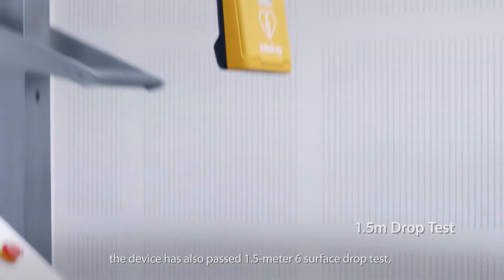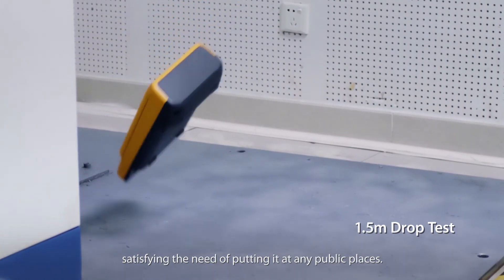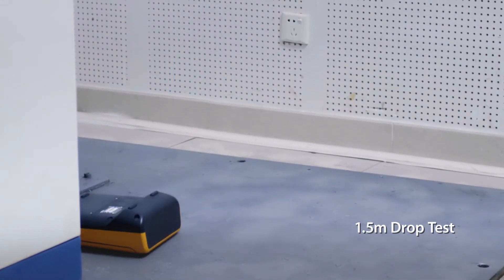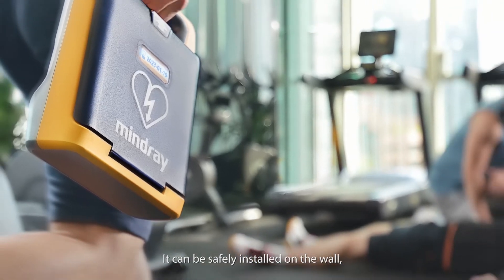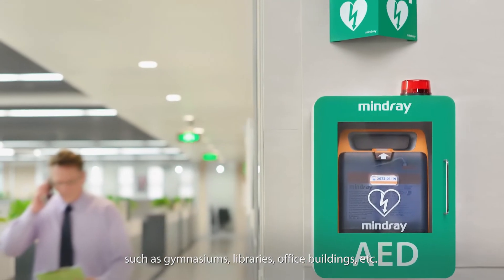The device has also passed a 1.5-meter surface drop test, satisfying the need of placing it in any public location. It can be safely installed on the wall, such as in gymnasiums, libraries, office buildings, etc.